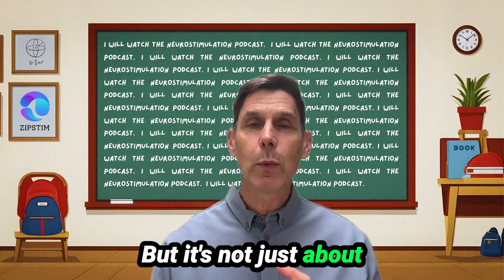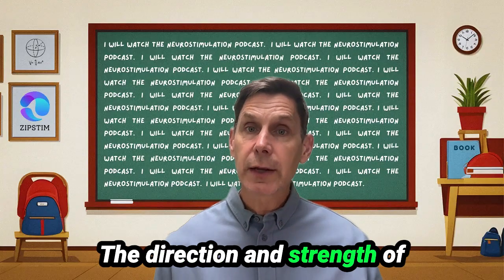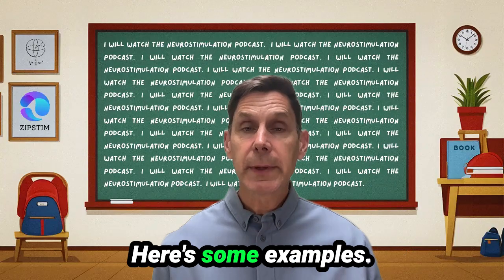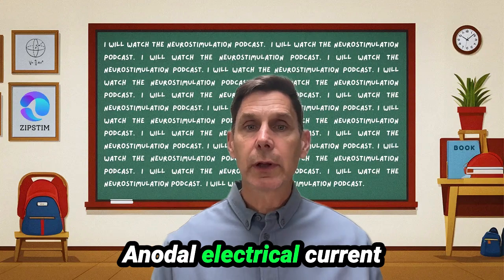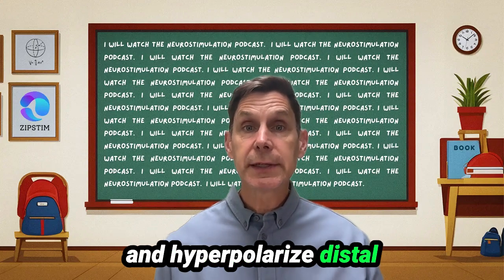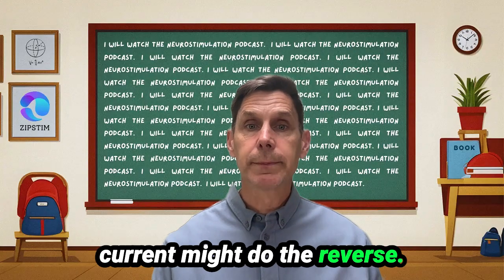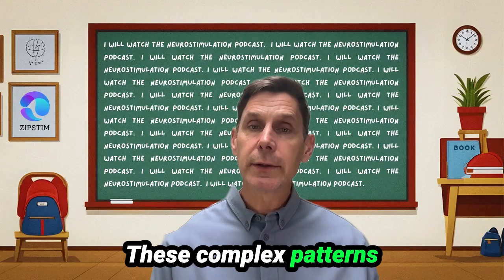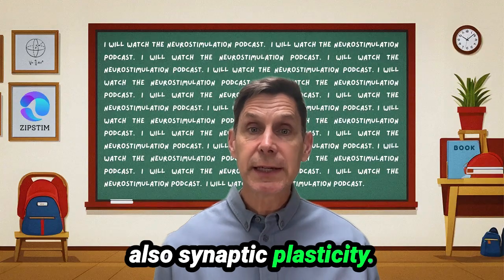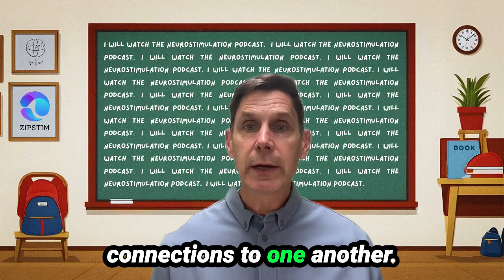But it's not just about whether a neuron is excited or inhibited. The direction and strength of that current affects different compartments of the neuron. Here are some examples. Anodal electrical current may depolarize the soma and hyperpolarize distal dendrites, whereas cathodal current might do the reverse. These complex patterns influence not only the firing rate of neurons, but also synaptic plasticity. This is the way that neurons strengthen or weaken their connections to one another.